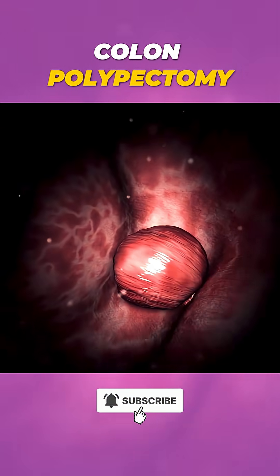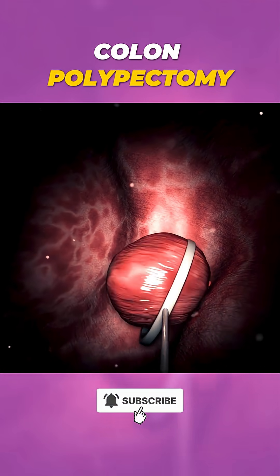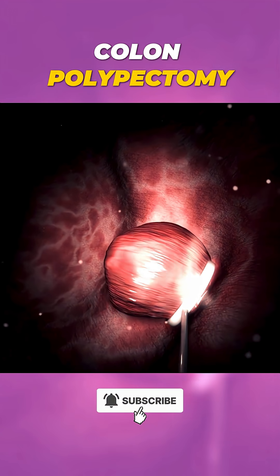a special wire loop or snare is used to encircle and cut it off, often with a mild electric current to reduce bleeding.